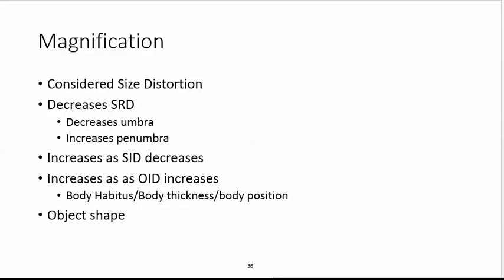C-spines. Remember last semester when we talked about the anatomy of interest on an oblique of the C-spine, what we're looking at is the intervertebral foramina. And on an AP oblique, the foramina that we see is the side that's elevated further away from the image receptor. On PA, it's closer to the image receptor.